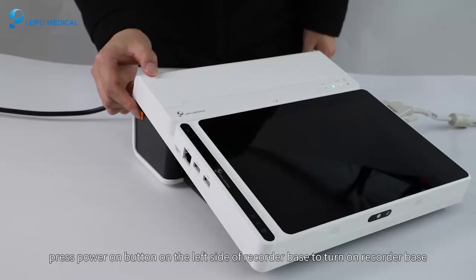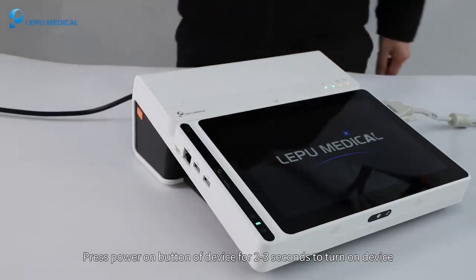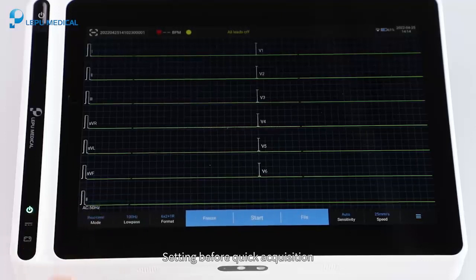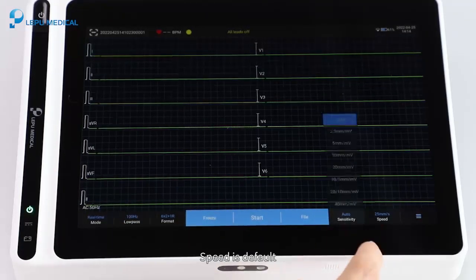Press the power on button on the left side of the recorder base to turn it on. Press the power on button of the device for 2-3 seconds to turn on the device. Before quick acquisition, set the sampling mode — default is real-time sampling — and format such as 12+1 or 6+2+1. Speed is default.